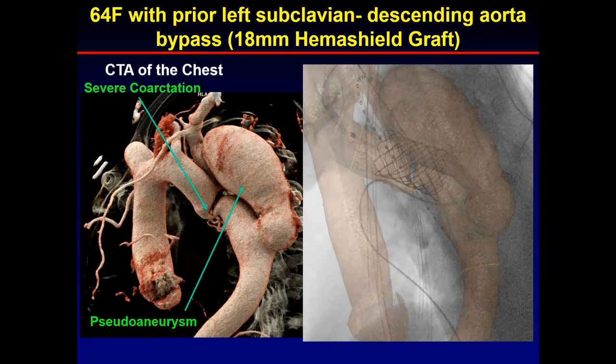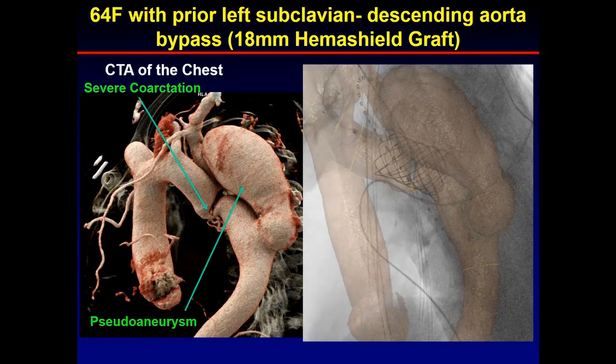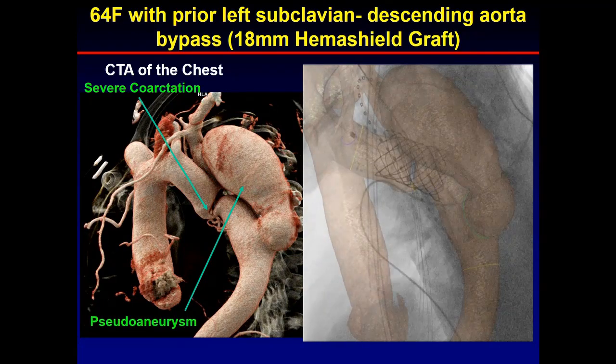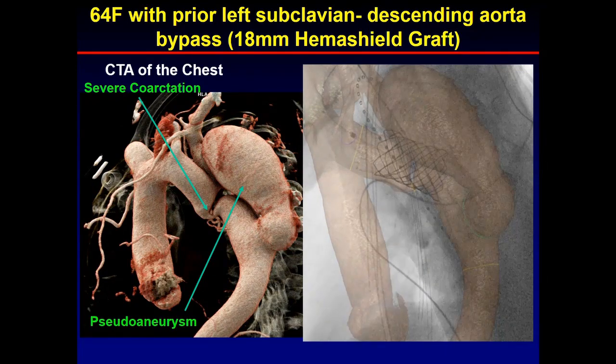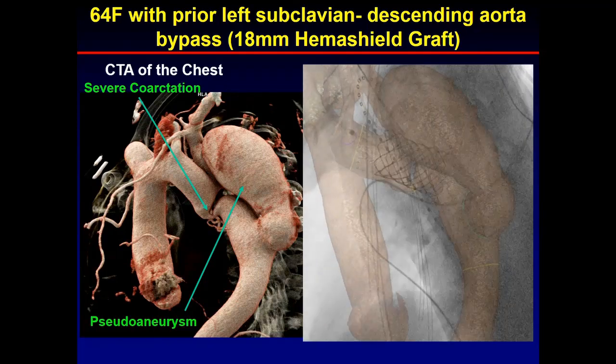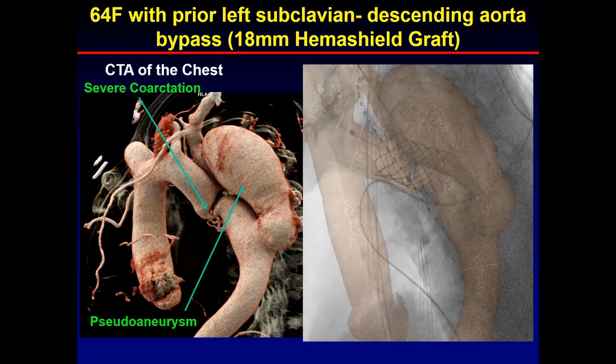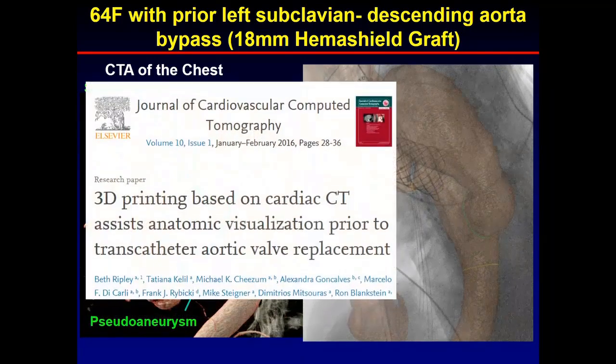So maybe in this particular case, if we had actually done more co-registration in the cath lab, we might have been able to better position the valve, because that calcium obviously made a big impact in terms of positioning that valve. We might have been able to do a better job using co-registration to help properly put the valve in the right place to begin with, instead of dealing with the complication of hypotension and shock. And there actually are some papers now that have been published.